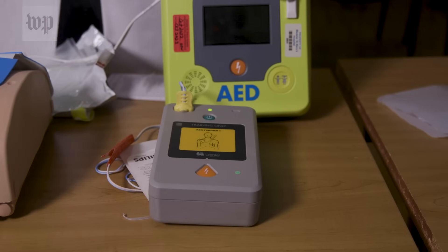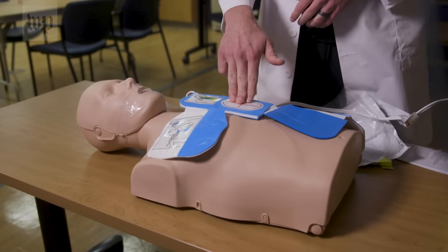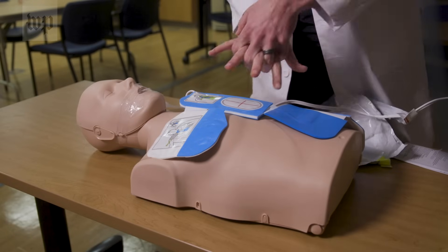You press the device — it delivers the shock. Then again afterwards, if you know CPR, you can go back to doing CPR. This device provides the area where you should be doing CPR with a small circle diagram. That is where you perform CPR on the patient.